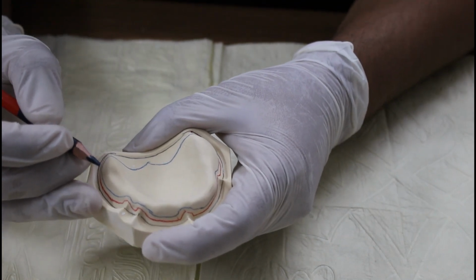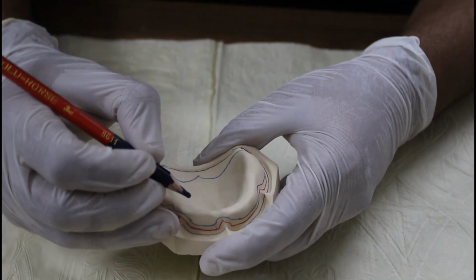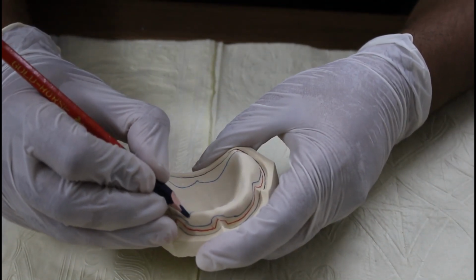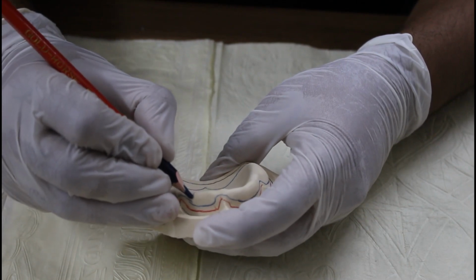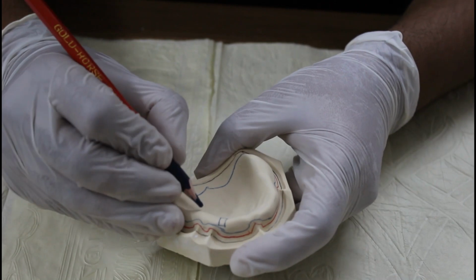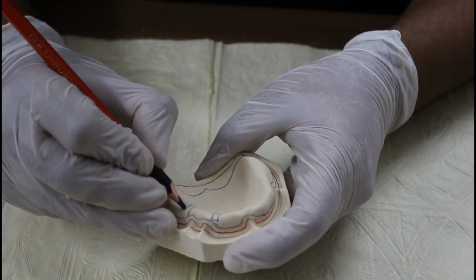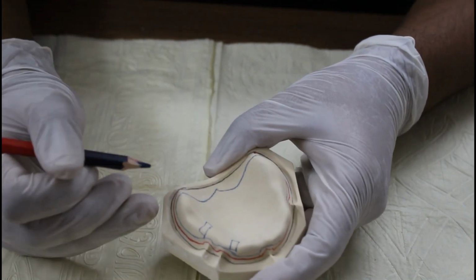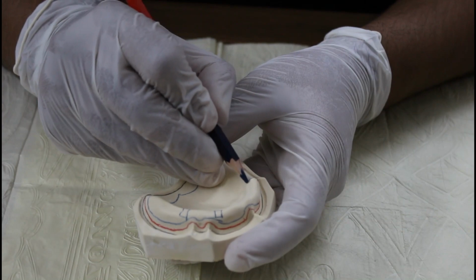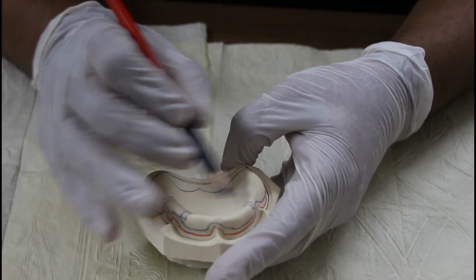These are called tissue stops. Tissue stops. What we will do, we will make 4 millimeter by 4 millimeter squares like this in the first molar and canine region on both sides, and we have to make sure that they are almost symmetrical.